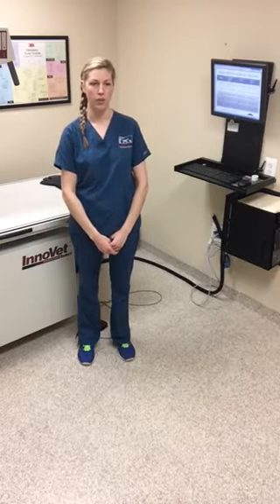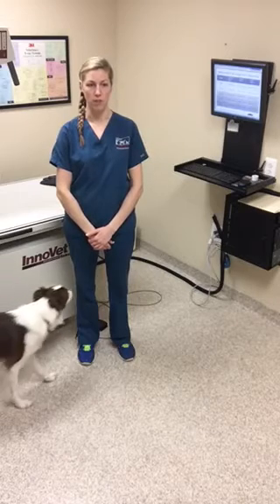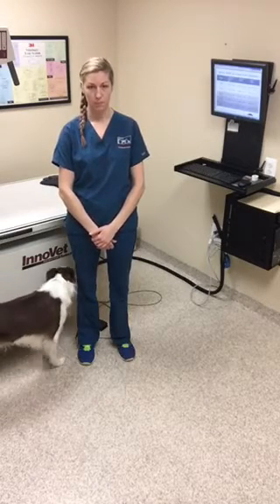At my practice, we are currently using the generic technique chart that was supplied with the purchase of our X-ray unit. It is important to keep in mind that these generic charts are just a suggested starting point, and that a set of customized technique charts specific to each X-ray unit must be constructed due to the inherent variables of each imaging system and various species and anatomical differences.